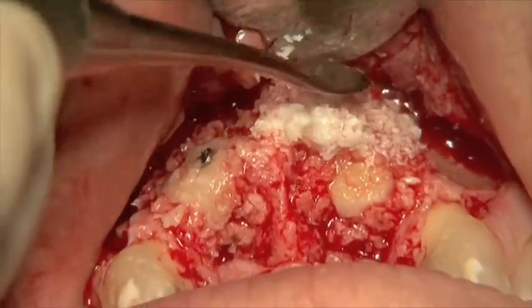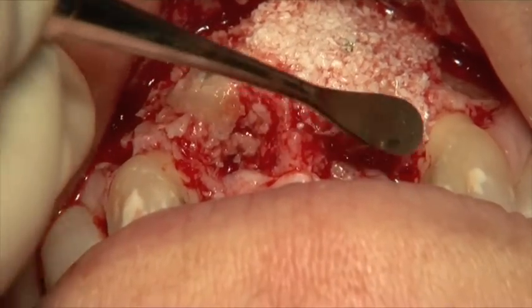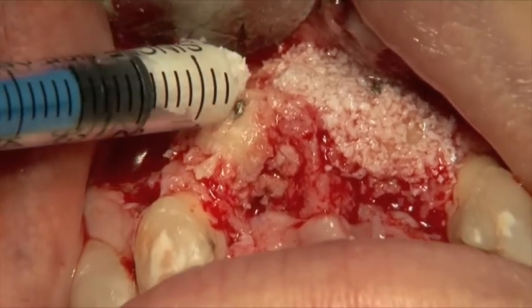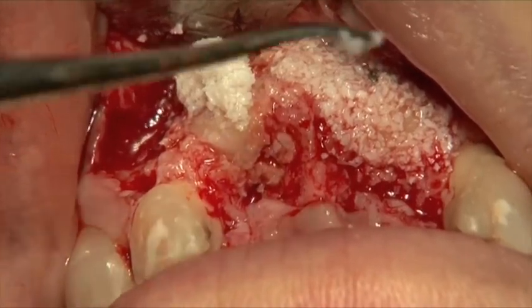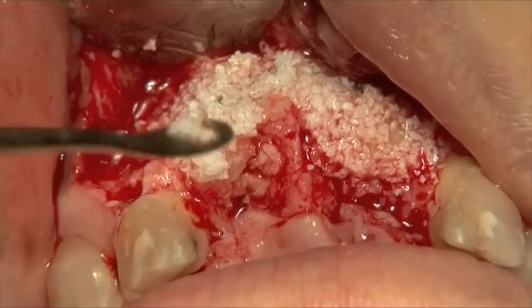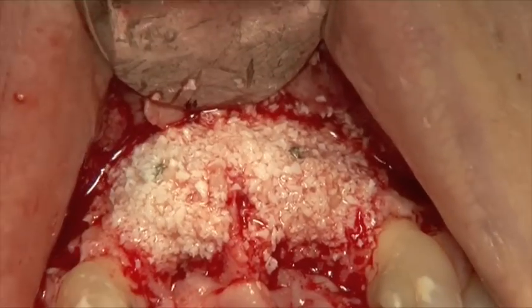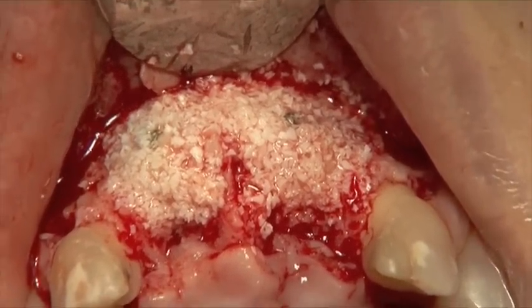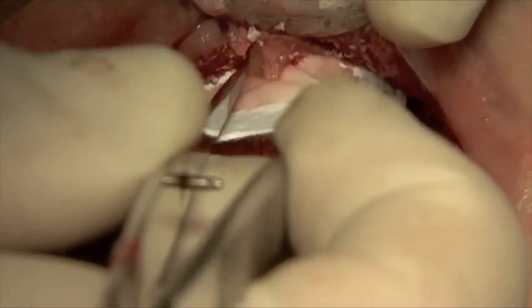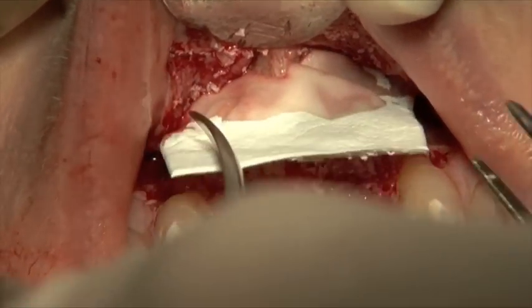That is just an insulin syringe that I'm using. There you can see the final graft there, and we're just going to put the membrane in. The more membrane you put there, the more issues you're going to have. The fact of the matter is here I don't really need membrane, because the bone block itself is good enough as a membrane on its own.